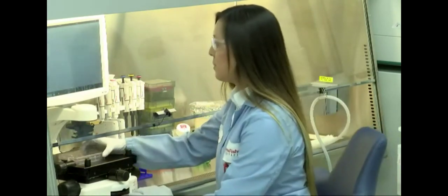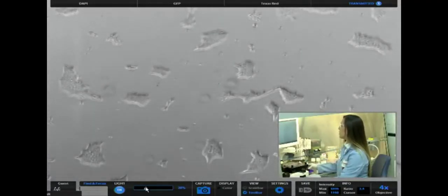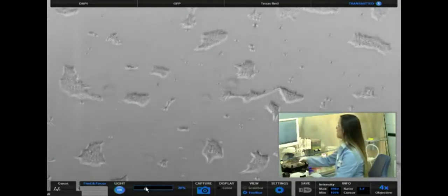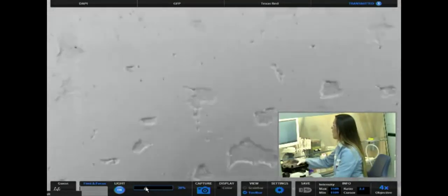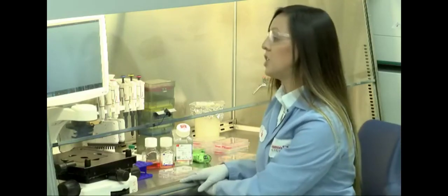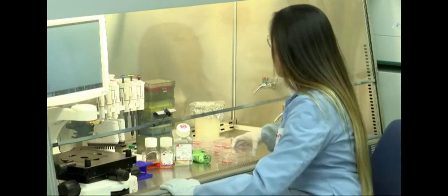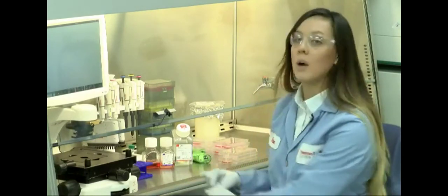So the next day, which would be day one, you want a culture that's going to be about 15 to 25% confluent. That's the range. And it looks like we've got this here. So on day one, after you have replated your PSCs, you're actually going to change into your neural induction media. And our neural induction media is basically just our neural induction supplement plus our neurobasal media. So once we change our media, you're going to change the media, 2 mL per well, on that day one. And then you're also going to change the media day two, day four, and day six.